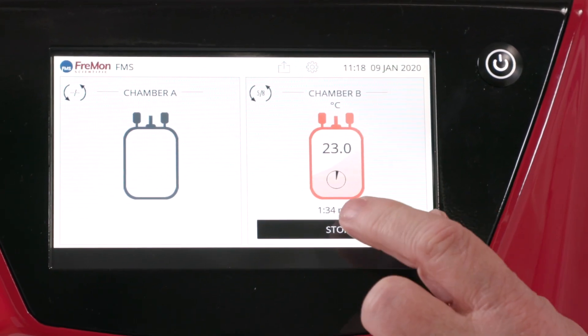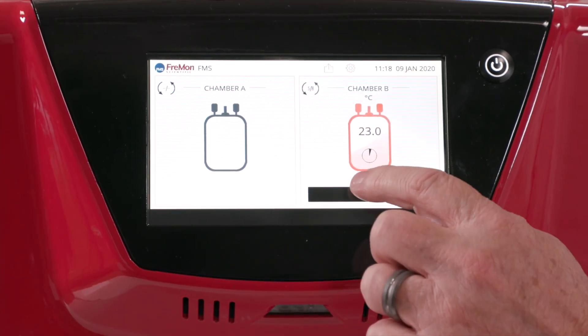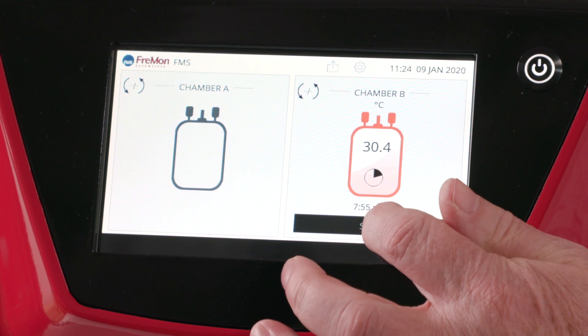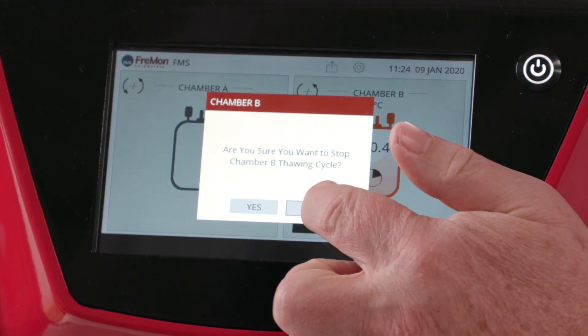Here's an overview of the screens during the thaw cycle. We'll start with the real-time temperature reading and the elapsed time count. You can stop the thaw at any time by clicking stop — you'll see the confirmation menu. We'll click no to keep going.